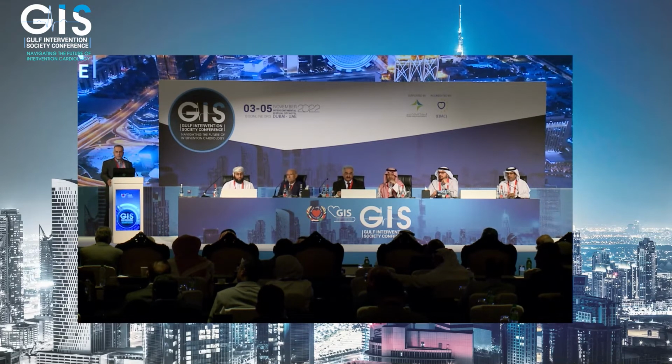Dr. Almerri, you started with intra-aortic balloon pump and you end up with intra-aortic balloon pump recommendation in a cardiogenic shock with left main unprotected. Do you believe that we have benefit from intra-aortic balloon pump in presence of the Impella and ECMO and other things? Because the 3 cases you have presented, all of them, you have utilized intra-aortic balloon pump.